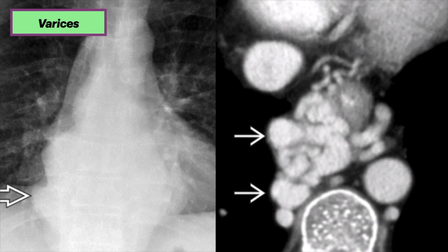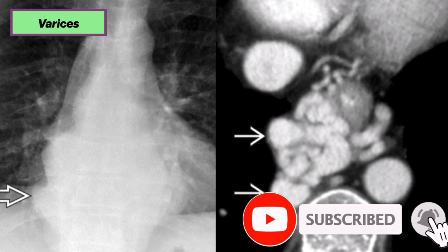Our last case is one of varices. The chest X-ray of a patient with alcoholic cirrhosis shows lobulated masses near the gastroesophageal junction with lateral displacement of the azagoesophageal recess. The contour abnormality of the lower azagoesophageal recess is the most common radiographic finding of paraesophageal varices. Axial CT shows multiple dilated, enhancing paraesophageal varices to the right of the esophagus in the region of the azagoesophageal recess and surrounding the distal esophagus.